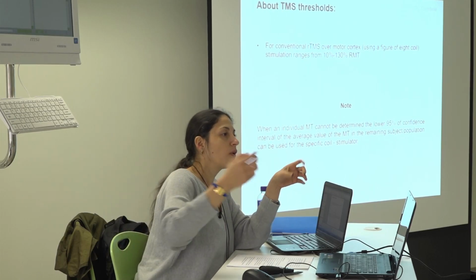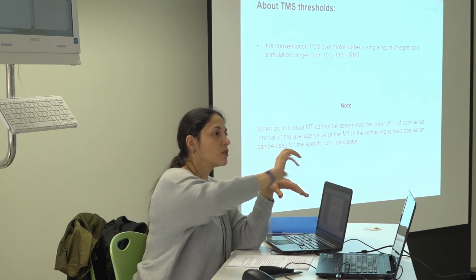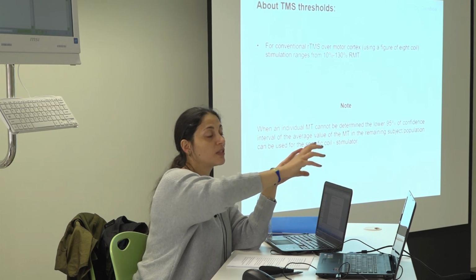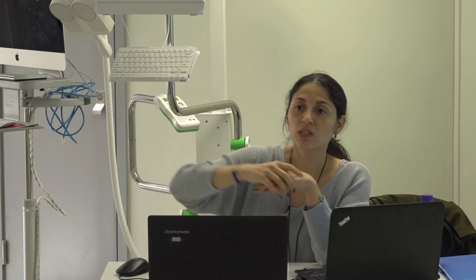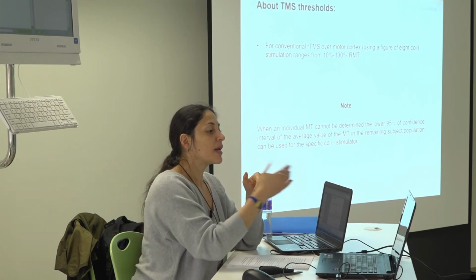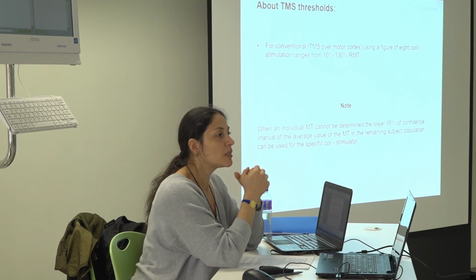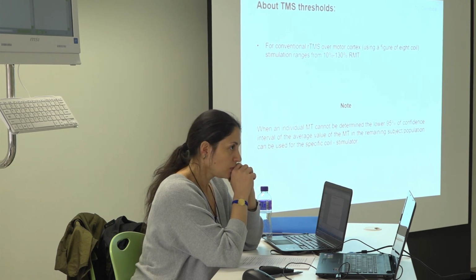A value. The value could be from 0 to 100 on my stimulator. So 50% of the stimulator output, 60, 80, 70. Just suppose I find that my resting motor threshold for this person here requires 60%. And the maximum I can apply is 130%, so what would be my maximum to apply in a treatment or in a research question? Is it just simple mathematics?